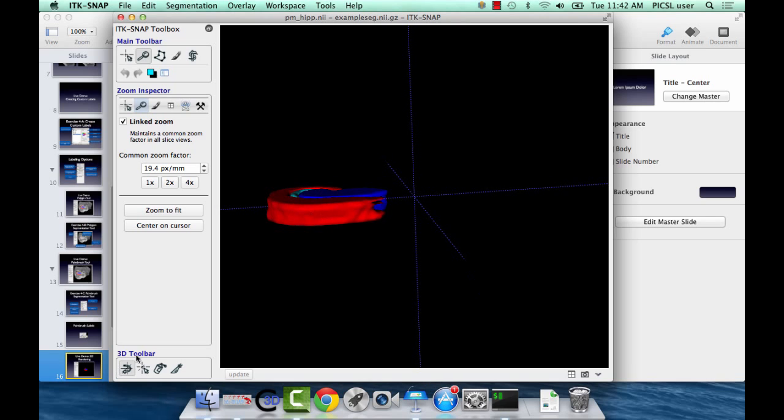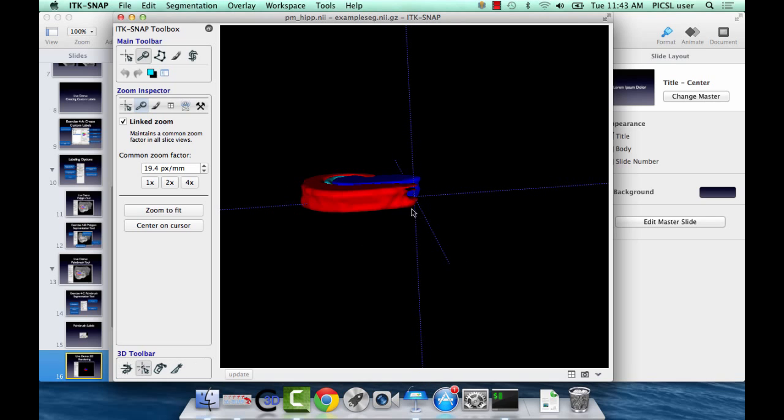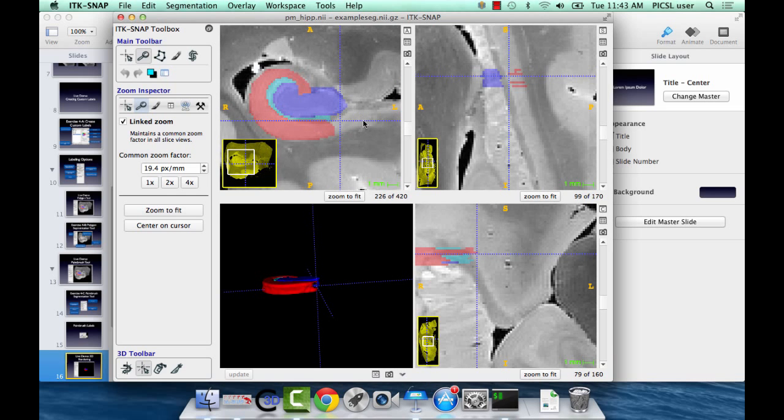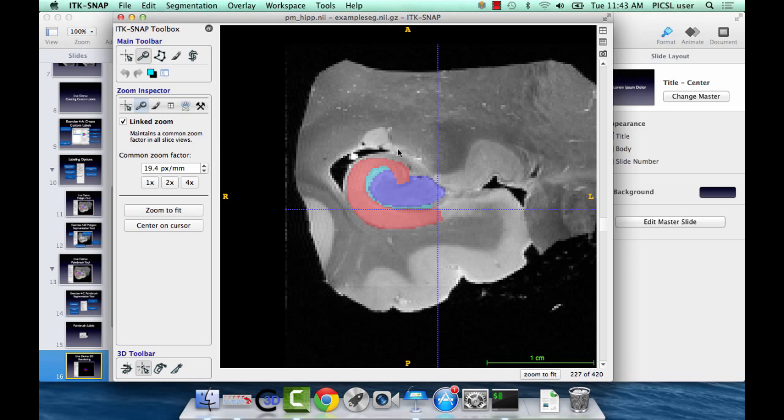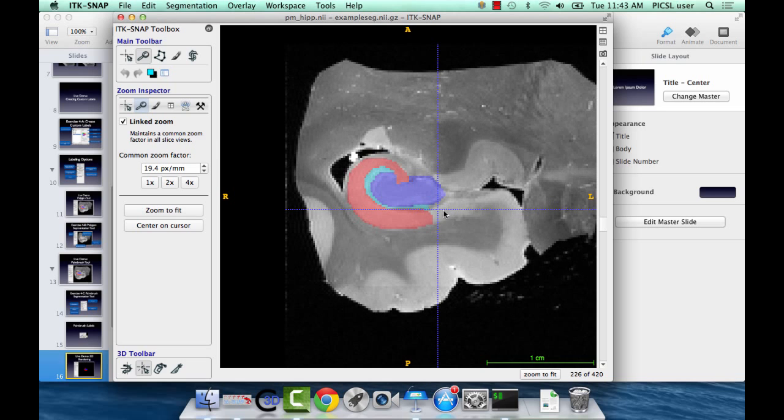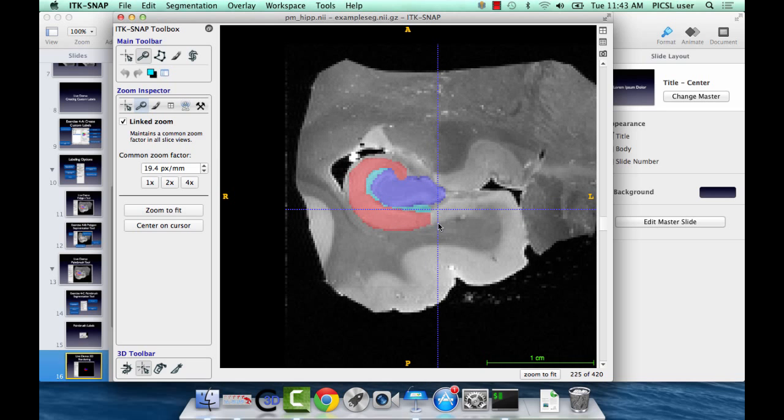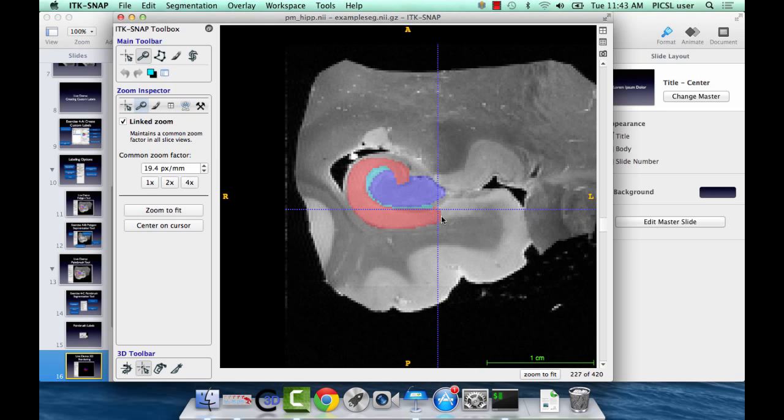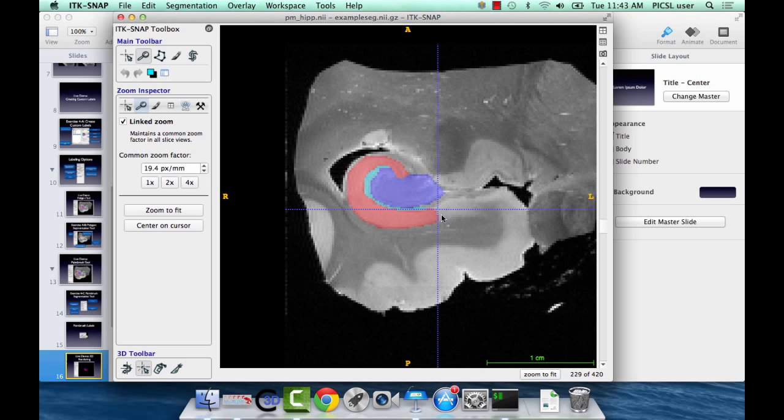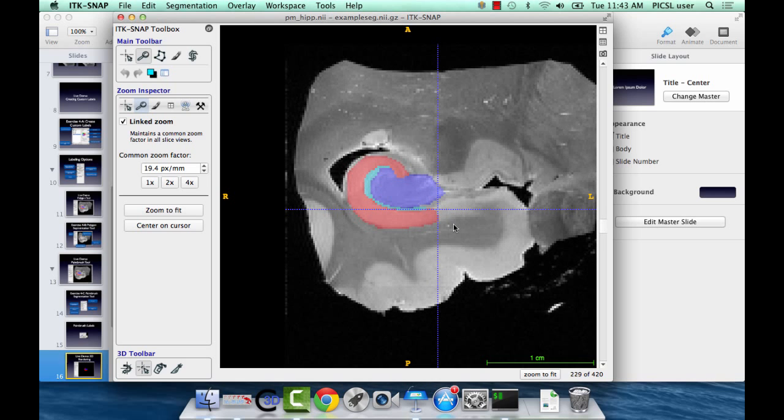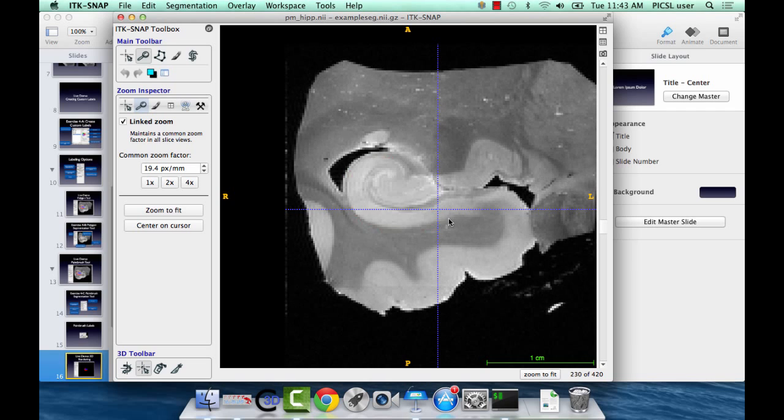We have this middle slice is much more shallow than these other two slices, which is kind of suspicious. So, you can take the 3D pointer, put it in that region, and then look back at our slice and see what's going on there. So, if we look at these slices sequentially, see where the pointer is, we can see that this boundary is shifting between slices. So, for some reason or another, I haven't defined this consistently. So, that's the kind of error you would use the 3D rendering to look for.